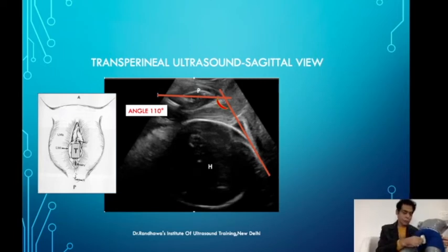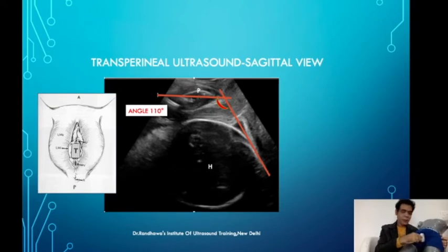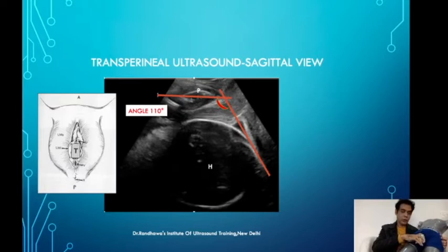This is how we place the probe. We put the probe longitudinally — maybe a little bit oblique as well, but more or less straight. Looking at the probe position, it is kept here and we can feel the bony area of the pubic symphysis with the probe on top. Close to the upper part of the probe there will be the pubic symphysis, which we can feel with the probe.